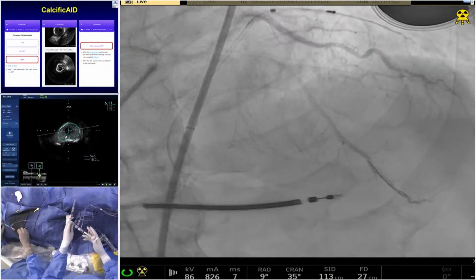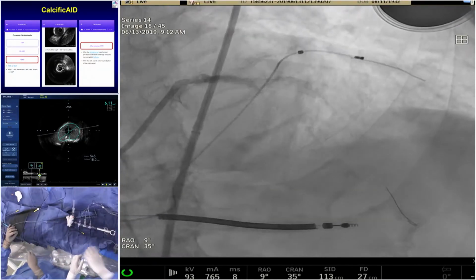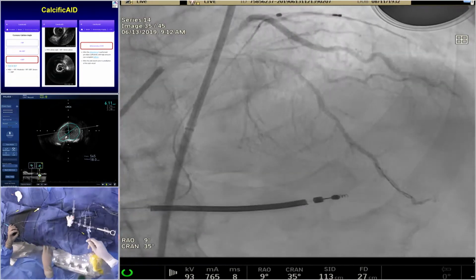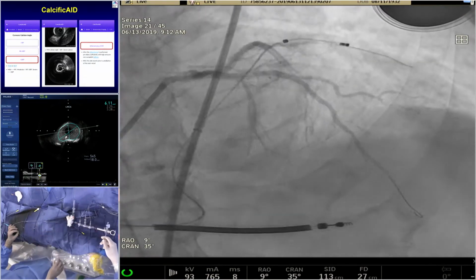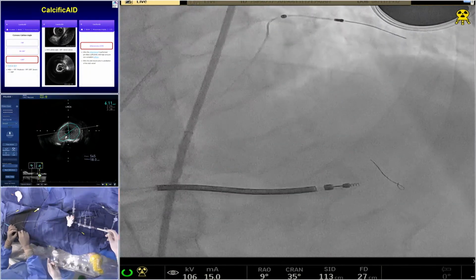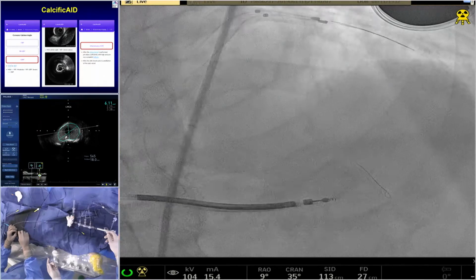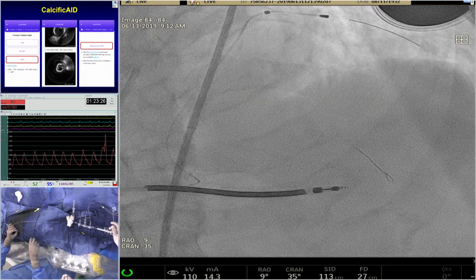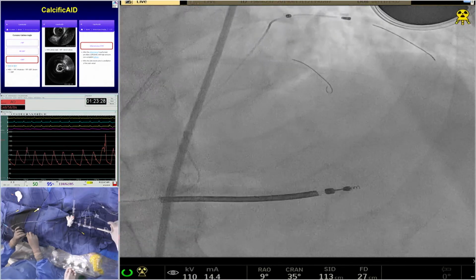Now you're almost committed to stent the whole LAD because she caused some injury with the 3.5 balloon all the way into the left main. There's a little dissection there, as you see. LAD means up to the left main. We could take one stent, no? I think you're committed to 2 stents from the LAD into the left main.